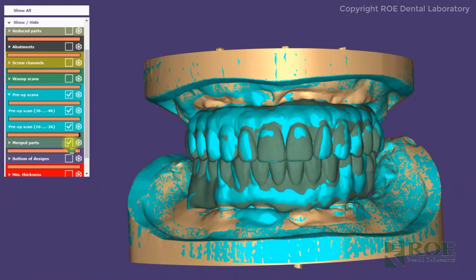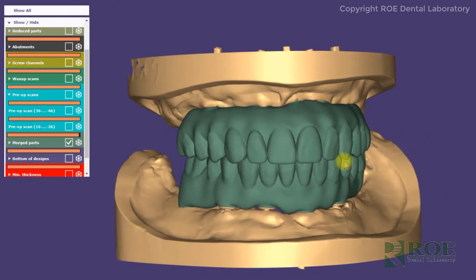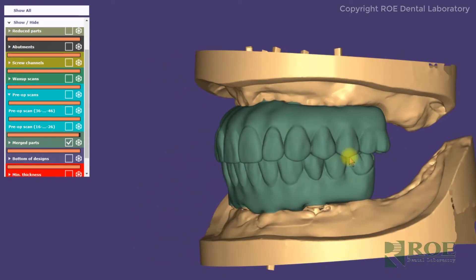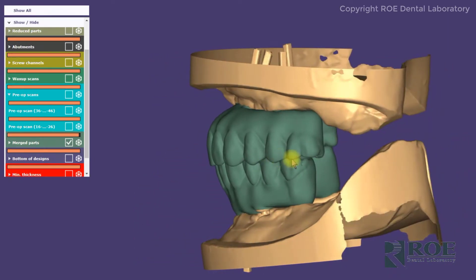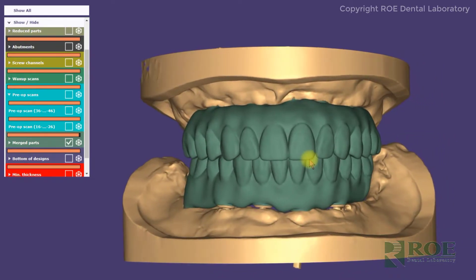Another layer that we share is the restoration that we're producing from those files with your changes that you requested. The hunter green layer is the proposal for the final restoration. This is what we're going to fabricate as either a printed try-in or final, depending on what stage the case is at.